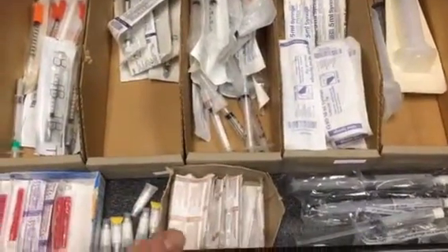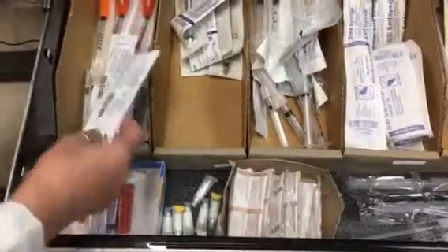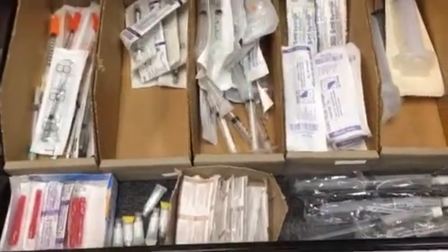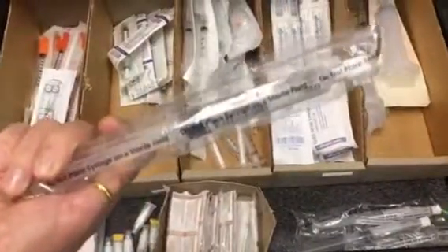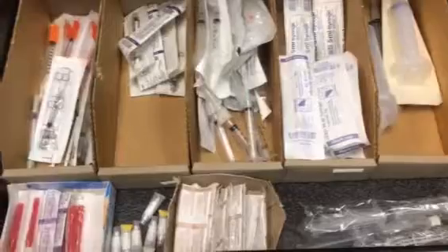For the RN student, you want to make sure that in this drawer we have a TB syringe and also an insulin syringe, so you need to make sure which ones you need. And we have pre-filled saline flush, and this is available in this drawer as well.